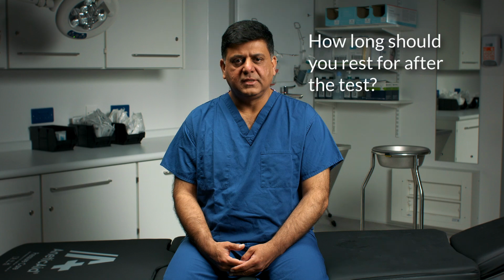What is the recovery process like? You can leave hospital shortly after the cystoscopy, but you will need to make sure you can empty your bladder properly in hospital before returning home. If you're unable to pass urine, you will be asked to stay in hospital until you can. When you are ready to leave, your consultant will answer any questions you have about recovering at home.